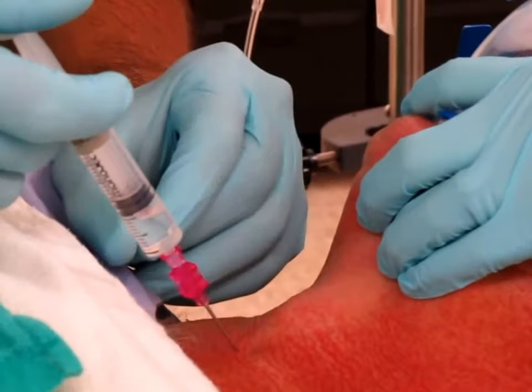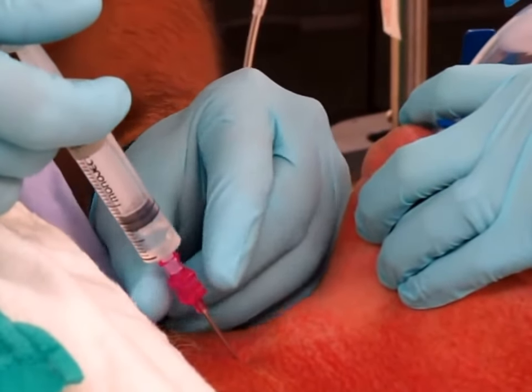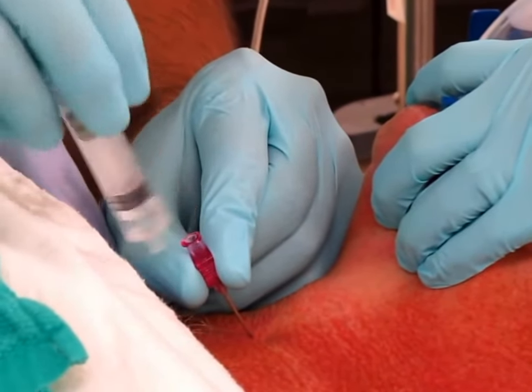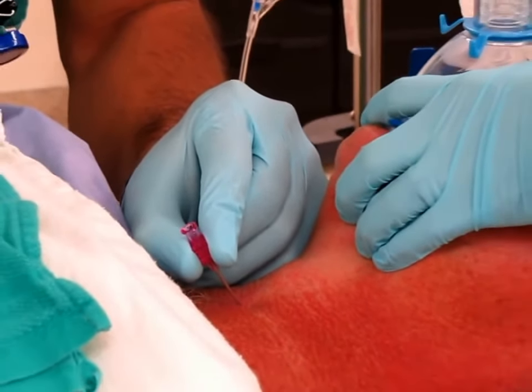Put the needle in. Keep the needle in and detach the syringe. Take your guide wire and thread your guide wire in.